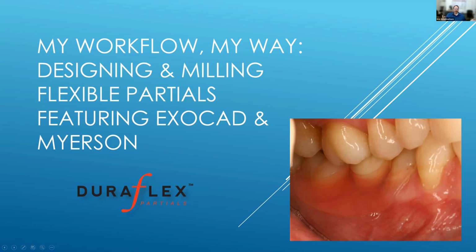And so I feel like I know Exocad really well. I've been using it for 11, 12 years, but there's definitely people out there that know way deeper levels of Exocad than I do. I'm not really here to be an expert on Exocad necessarily. I'm here to be an expert on Exocad specific to the DuraFlex material. And I just want to show you the little tips and hints and the things that I learned, and let you take advantage of me getting beat up developing this process over the years.